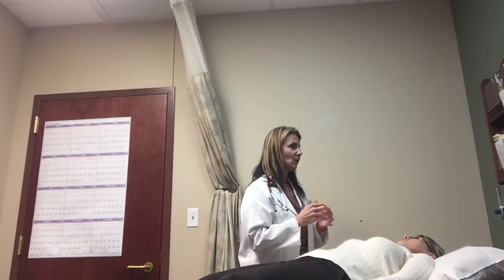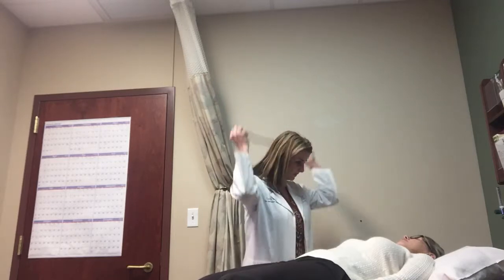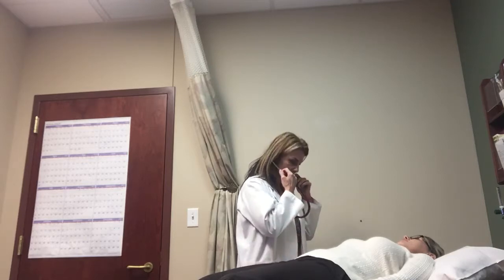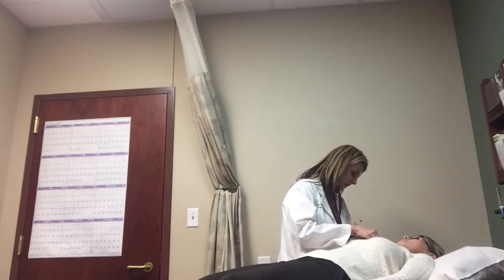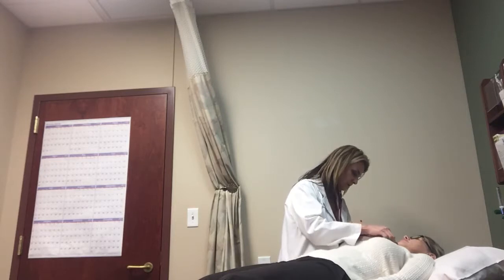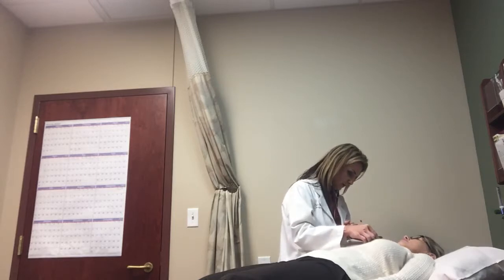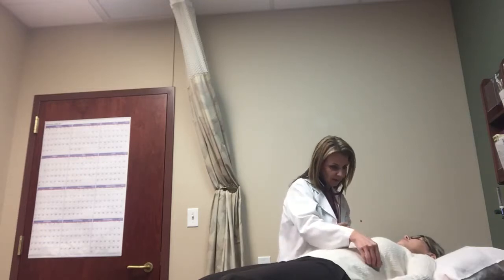So I'm going to go ahead right now, and I'm going to auscultate while you're lying down here with the stethoscope. I'm going to listen to the valves of your heart. And I'm going to start with the aortic, and the pulmonic, and Erb's point, and the tricuspid, and the mitral.